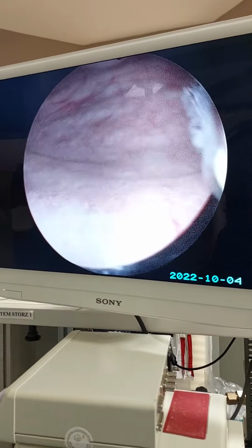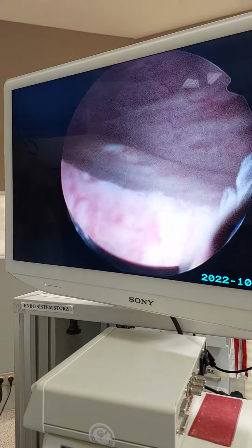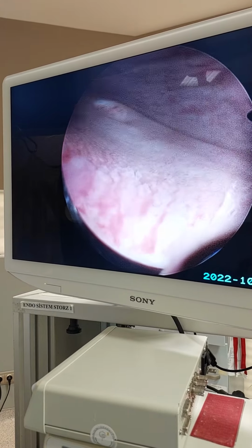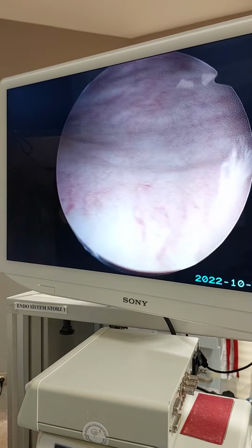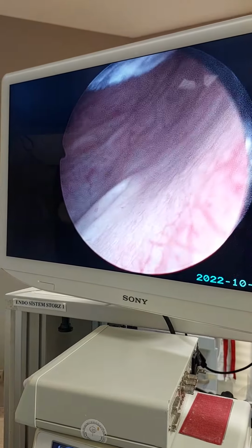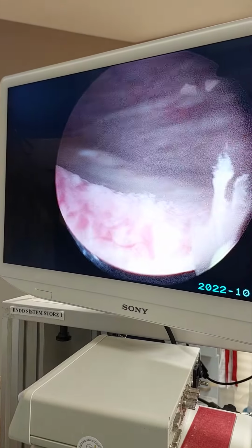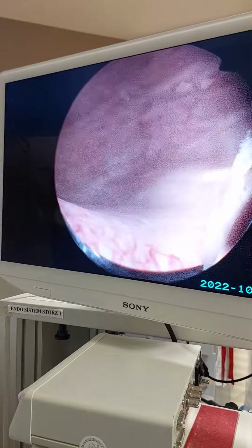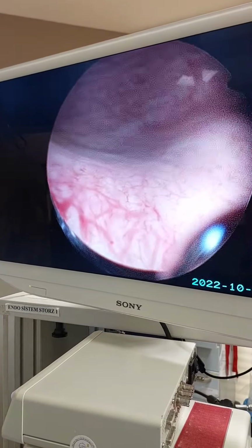Okay, now we are looking inside, and when we enter the bladder, quickly we see these abnormal leukoplakia tissues around the bladder neck. These are actually not extreme compared to many of the ladies, and this lady has a recent infection, not very old, a couple of years. And these are the patchy tissues.